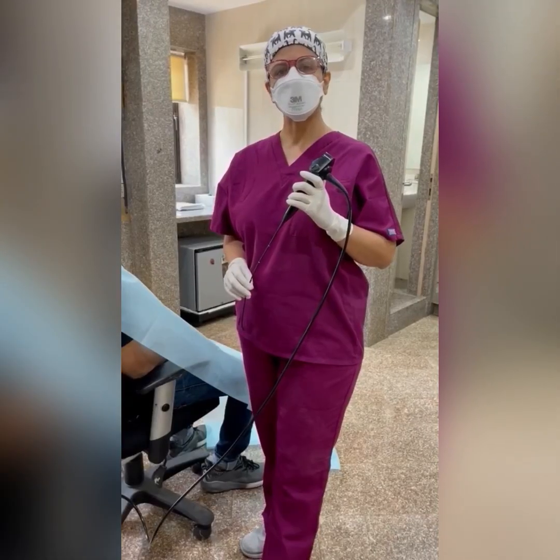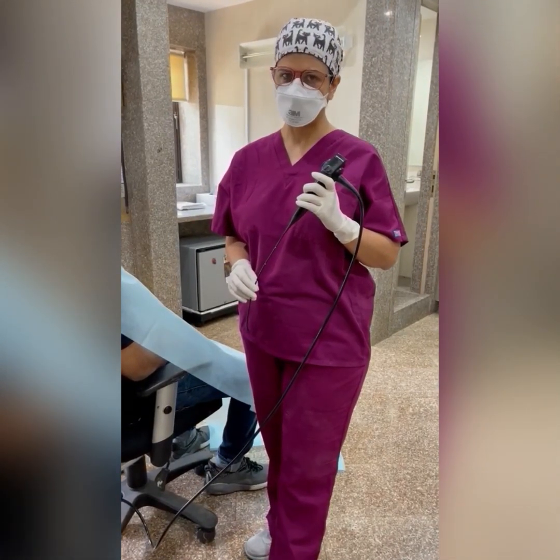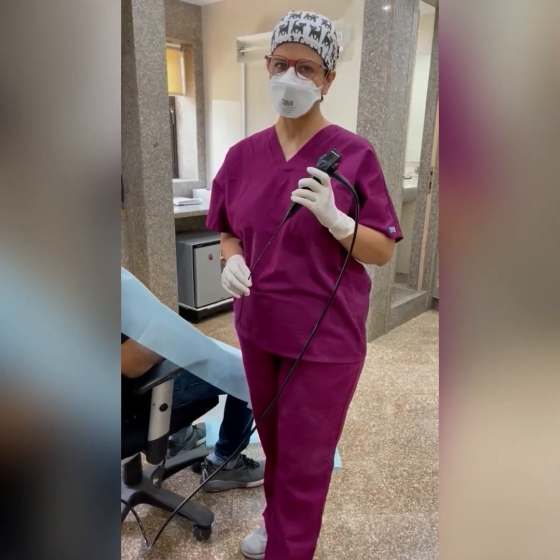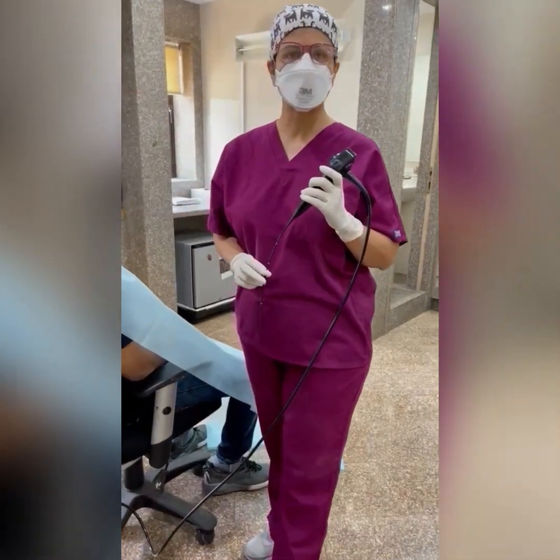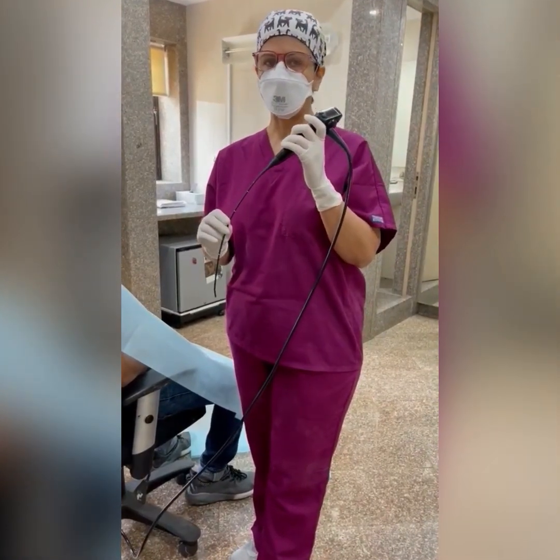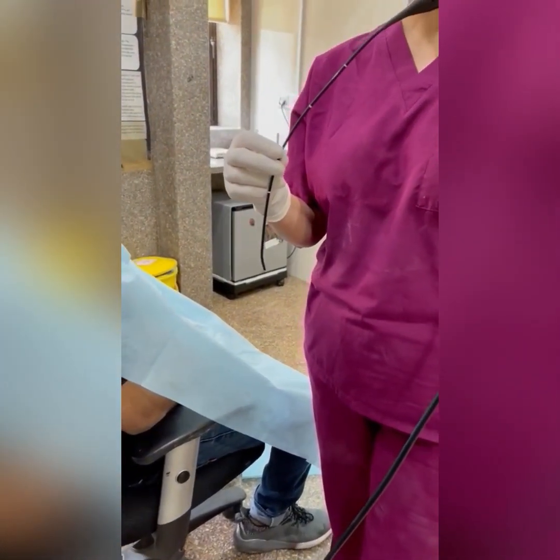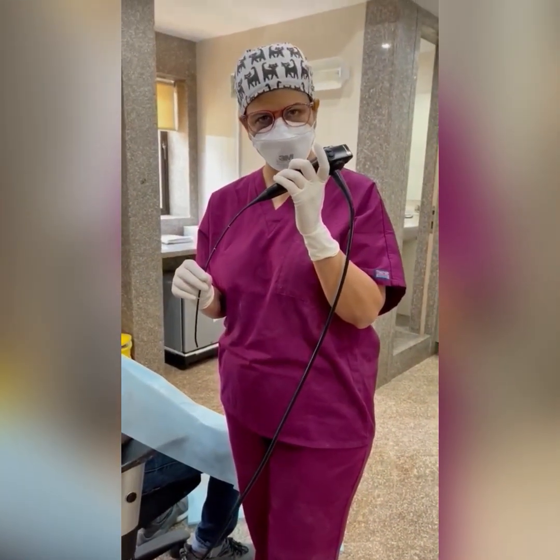Once we have decongested the nostrils, applied lidocaine in the nostril and oral cavity, given lidocaine nebulization, adequately anesthetized the larynx, and injected two percent lignocaine with adrenalin into the skin, we are ready to perform flexible laryngoscopy. Ideally, use a flexible laryngoscope with a side channel through which you can drip a few drops of lidocaine during the procedure as well.